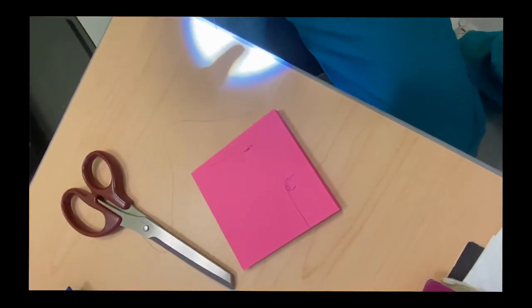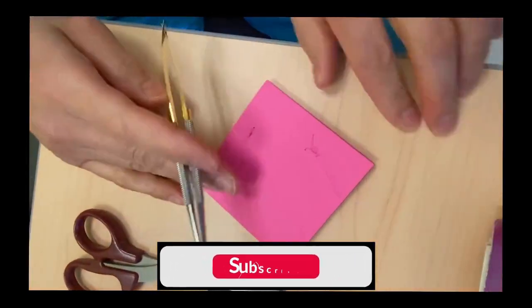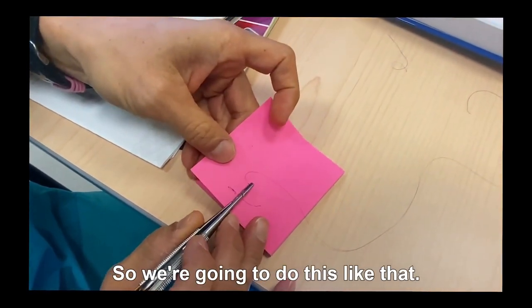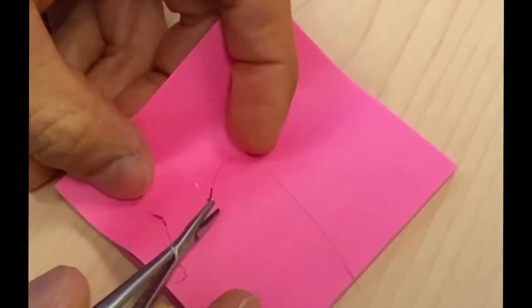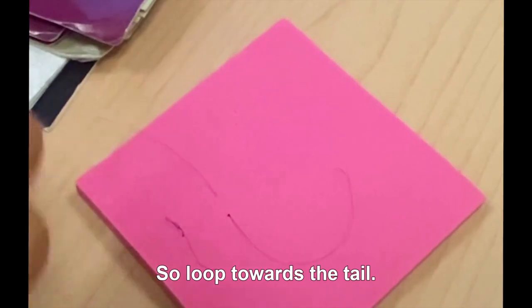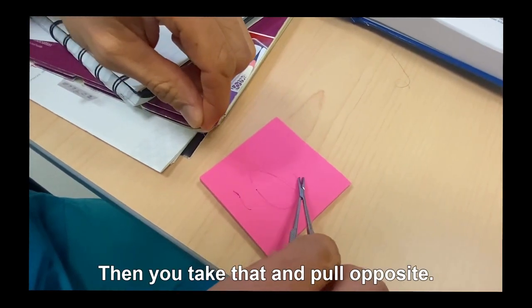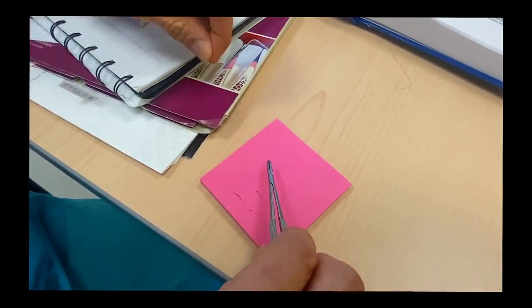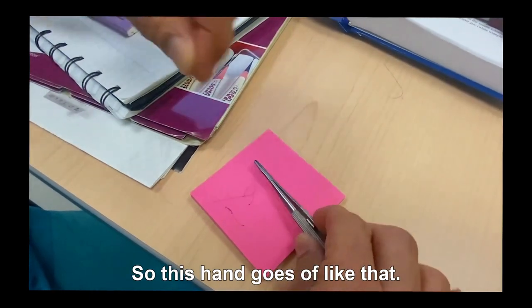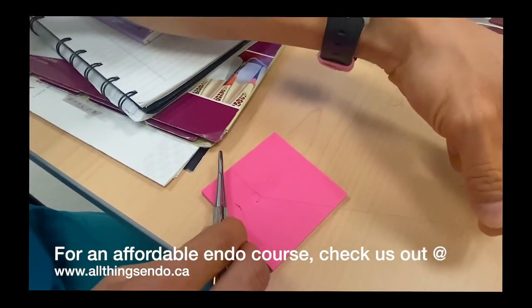A lot of people don't think about the difference — you just think you're tying whatever, but that's not the difference. Let me try again. So loop towards the tail — yeah, okay, that's right — and then take that and pull opposite. Pull opposite, so this hand goes up, like that. Oh wait — I went behind before, went in front.